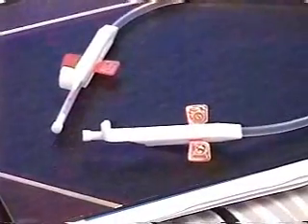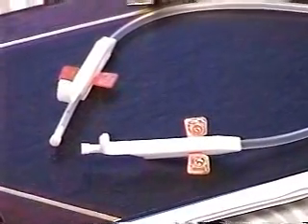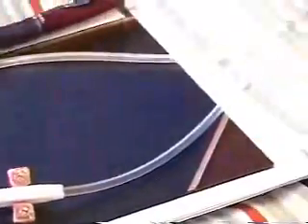I'm not sure what you call these — what do you call these things? Those are just connectors. They're probably the butterfly pressure connectors.